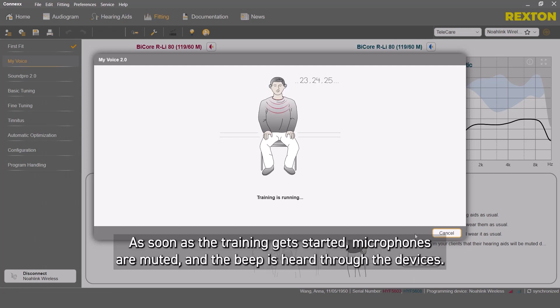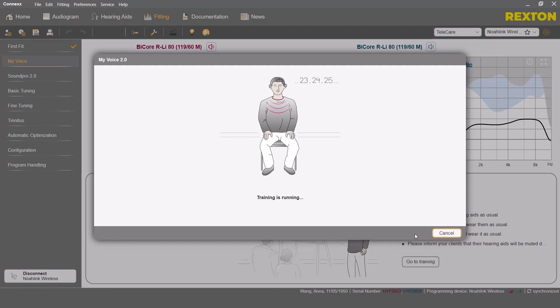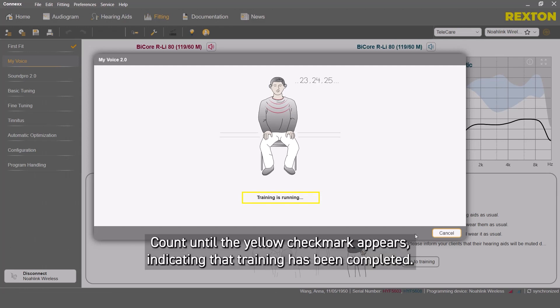As soon as the training gets started, microphones are muted and the beep is heard through the devices. Count until the yellow checkmark appears, indicating that the training has been completed.